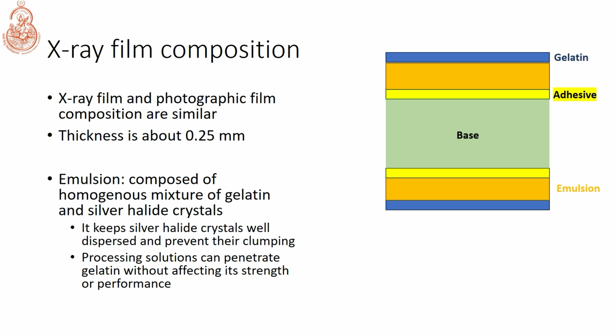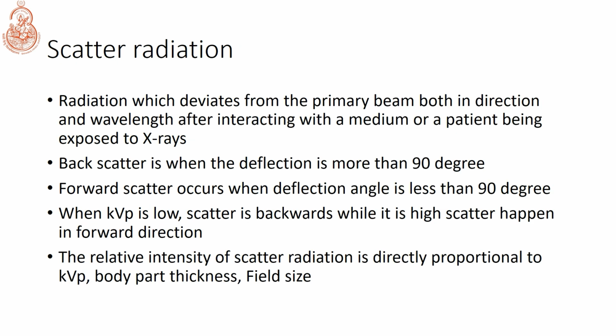Over the emulsion portion, we have a gelatin portion which is going to protect the emulsion portion of the X-ray film.